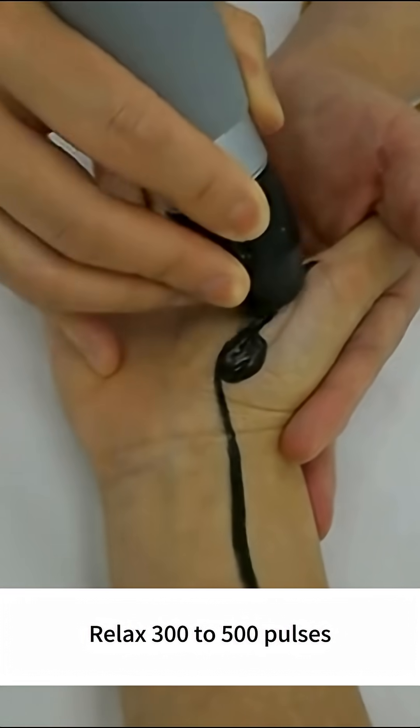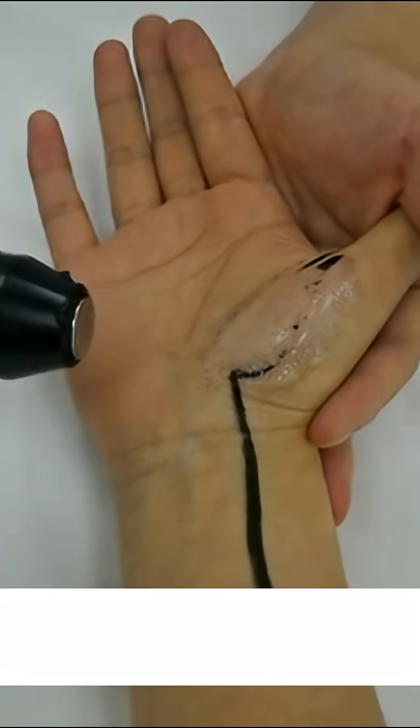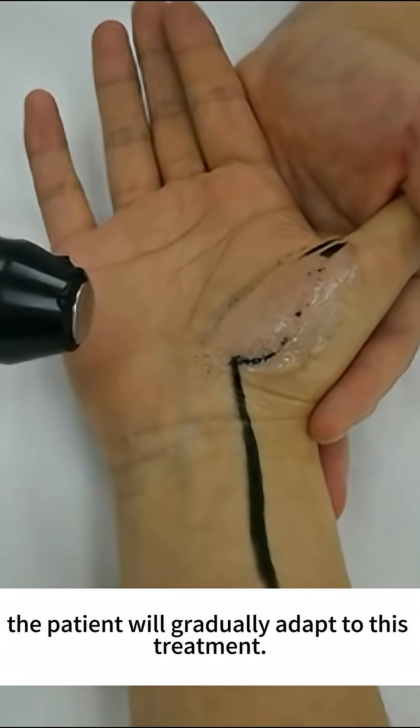Relax with 300 to 500 pulses. The patient will gradually adapt to this treatment.